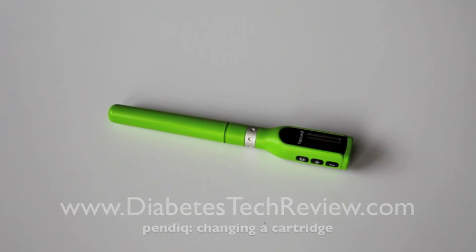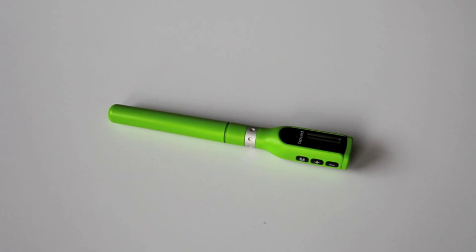Hi there, Dimitri Katz here again. Today with the Appendic Pen we will be changing a cartridge. I've done this a few times but every time I do it I still have to read the manual because it's not very intuitive. I'm going to go through the steps and hopefully this will give you an idea what you have to do. So let's take a look.